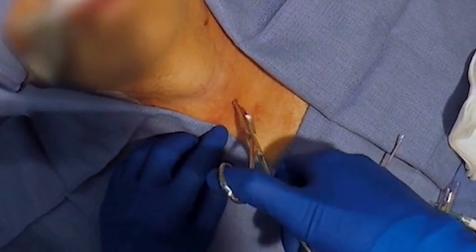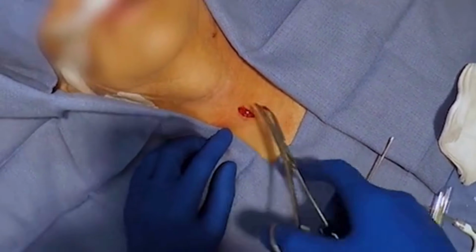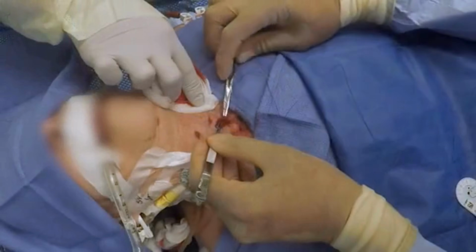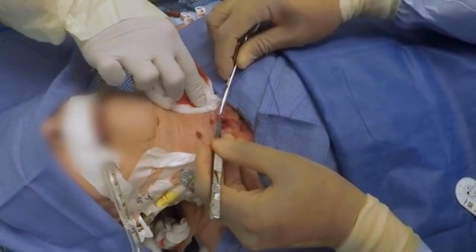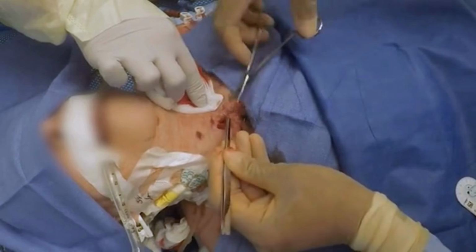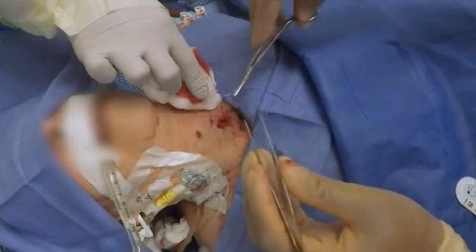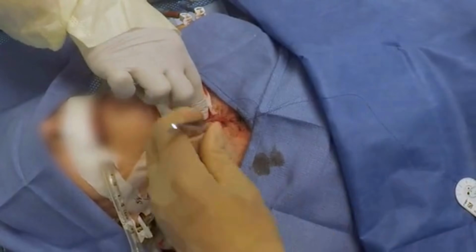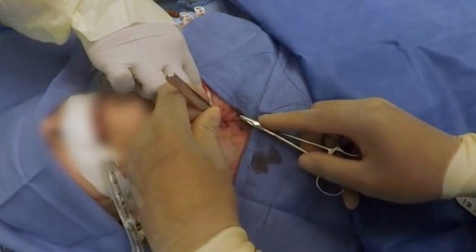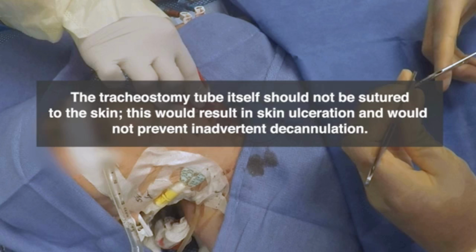In patients on therapeutic anticoagulation or at bleeding risk, consider placing a purse string suture around the incision using 2-0 Prolene. Place, but don't tie, the purse string suture at this stage. Tie it later for hemostatic control after tube insertion. Remove the suture on the second postoperative day if there's no bleeding. Don't suture the tracheostomy tube itself. This can cause skin ulceration and doesn't prevent decannulation.